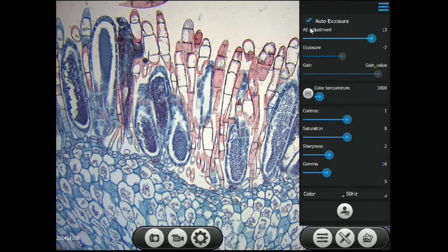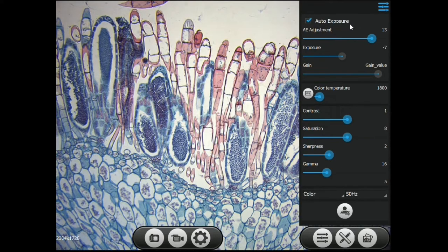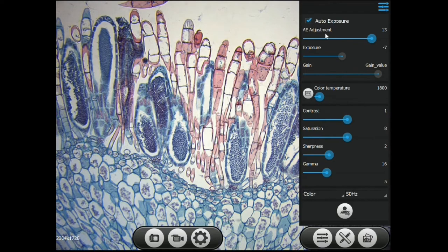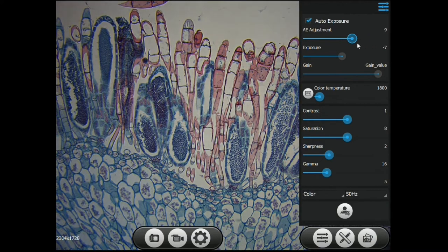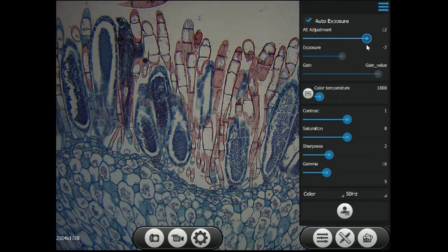To access your camera settings, hit the slider button. You can turn the auto exposure off, we recommend to leave it on. But if you would like to use the manual controls, you may, by turning it off. To adjust it with the auto exposure on, use this slider to adjust.